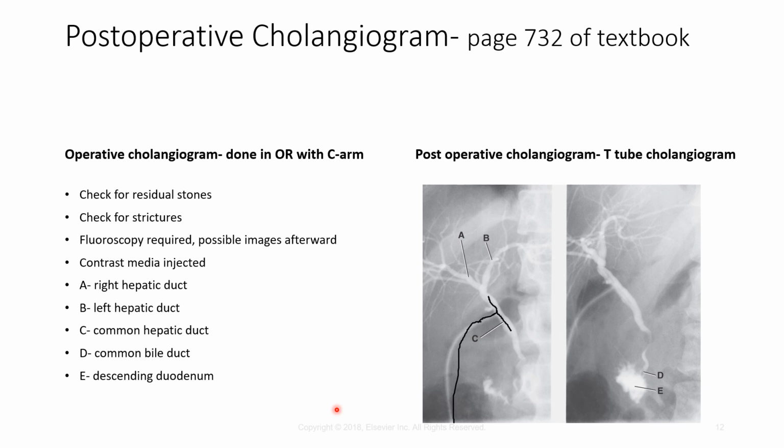So a postoperative, or what's called a T-tube cholangiogram, is on page 732. So make sure you listen to this, write down any questions you might have, and then when we meet again in class, hopefully I can answer them and we can have further discussion.